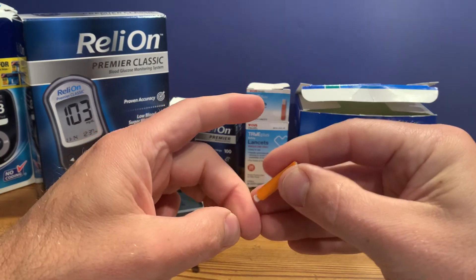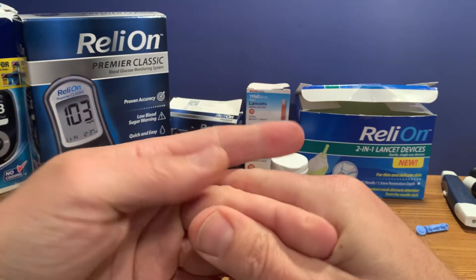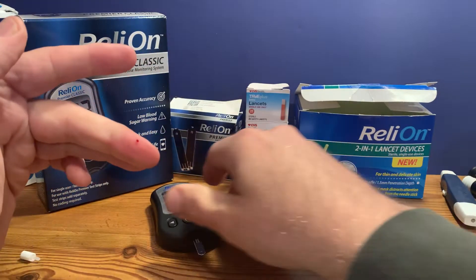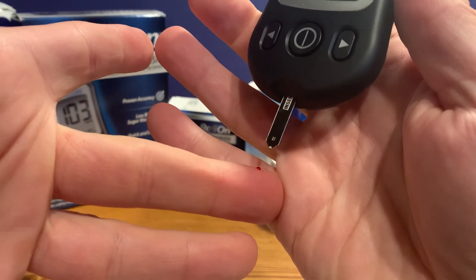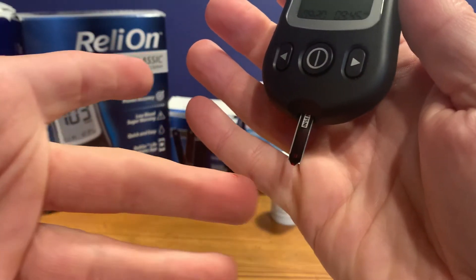Remember that you've washed with warm soapy water and dried. And there we go — just a little blood right there. Most test strips draw the blood up inside of them; you don't actually put the blood directly on the strip.